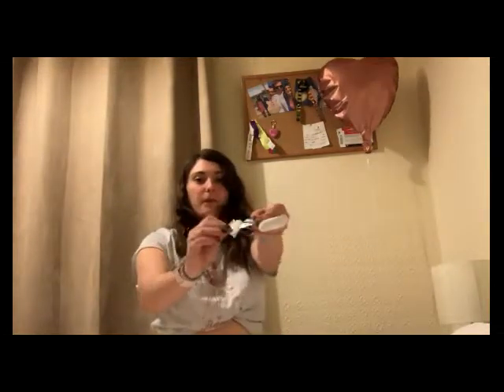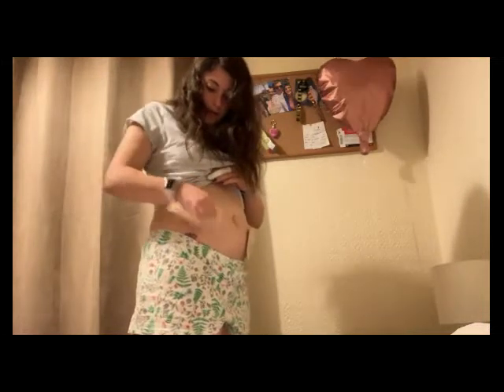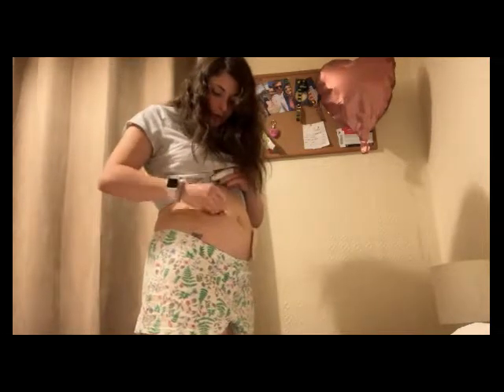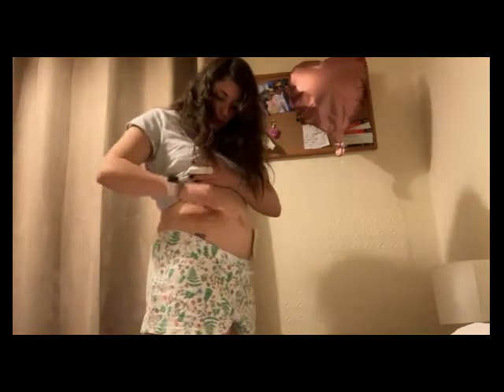Right, just going to wipe this side. Sorry if you can't see my face, guys. There are sticker marks from the old ones in the past as well. I've had such a bad run with these sensors lately. I don't know what I'm doing wrong. Out of 10 sensors, you usually get 2 faulty ones. That's kind of how it works with me. But when they work, they're amazing.